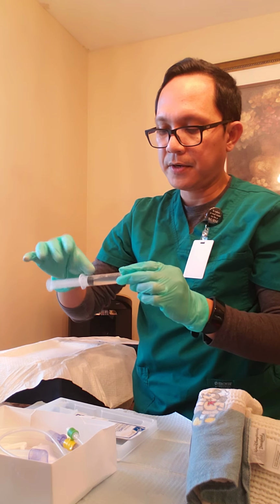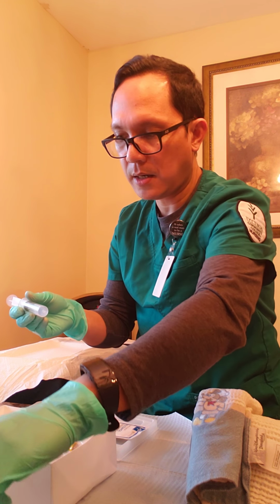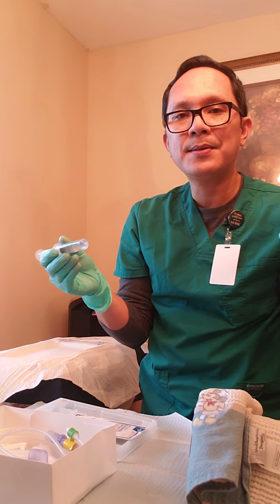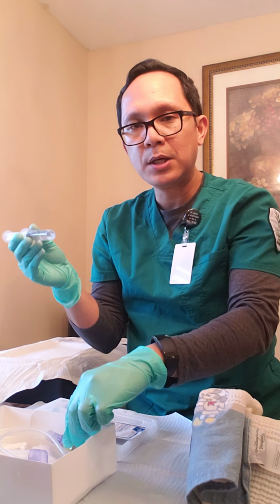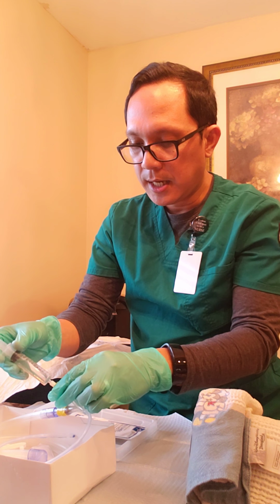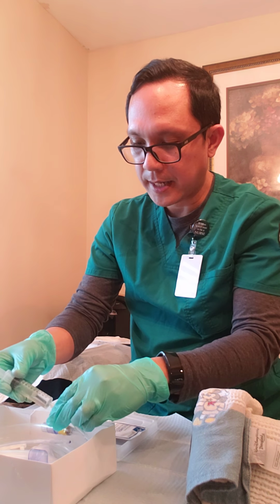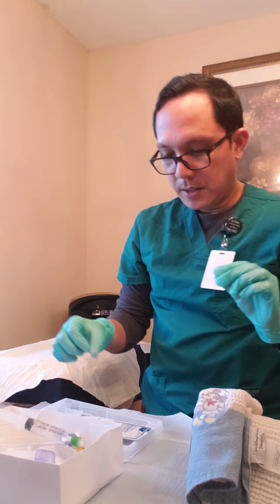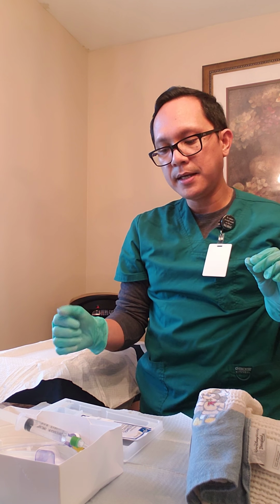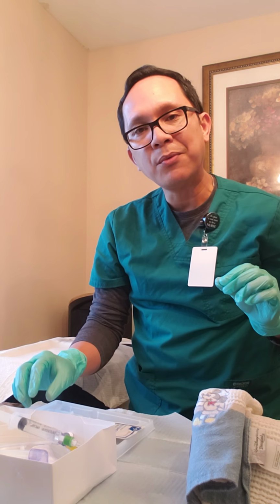And I have here the syringe with sterile water. We are going to be using this to inflate the balloon once we get the Foley inside. I'm just going to go ahead and insert it in the Foley catheter port. Okay, now that everything is ready, I'm going to ask my patient if she's okay, and we're ready to start.